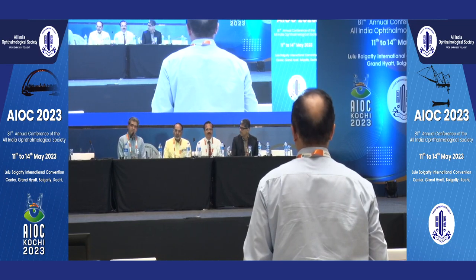It's a high definition camera which is attached there. You can actually go into the program and look at the picture, the HD photograph which has been taken by the machine. If the quality of that picture is good, then it is definite that you will get your registration. It's exactly the same with the Varion as well.